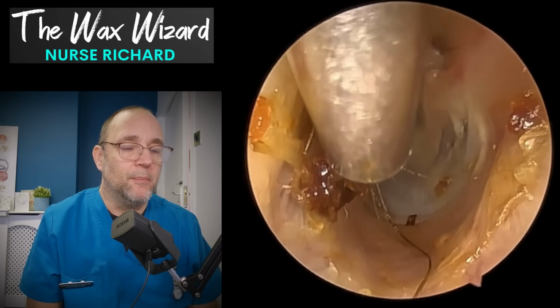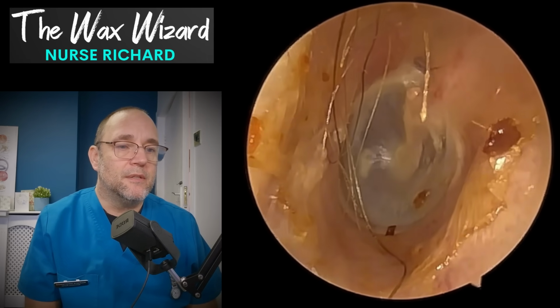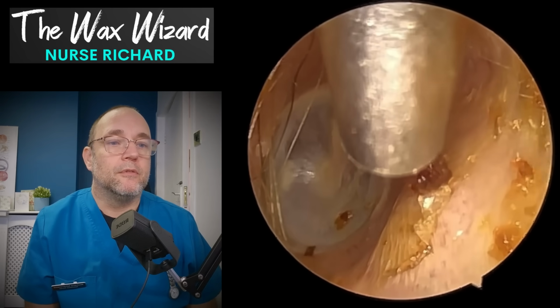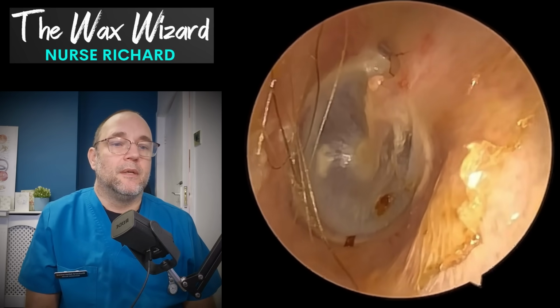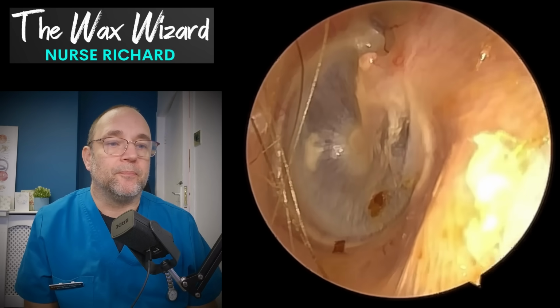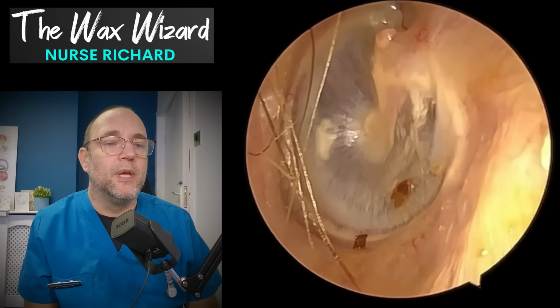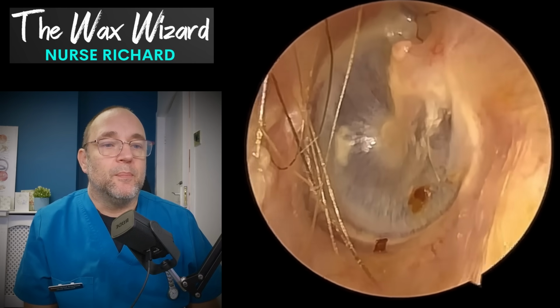You might already be able to see it. It's just to the centre right of the eardrum, as you can see. I'm going to zoom in in a second. Just going to get rid of that little speck there. I'm not getting involved in a peel there. There's absolutely no need. So I'm going to zoom in here, and can you see that pulse in there? You're probably thinking, well, I kind of knew what it was straight away, but there's a couple of things you can do to confirm it. So yeah, you can see it pulse in there.